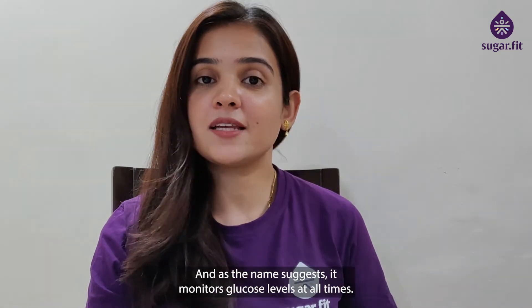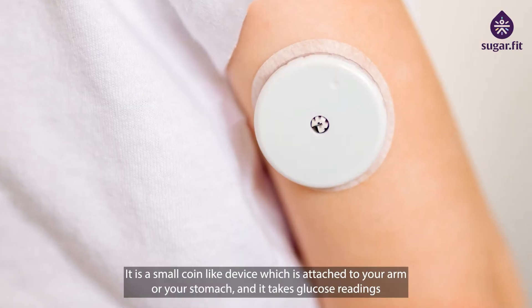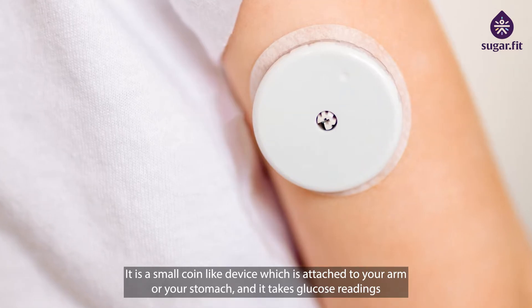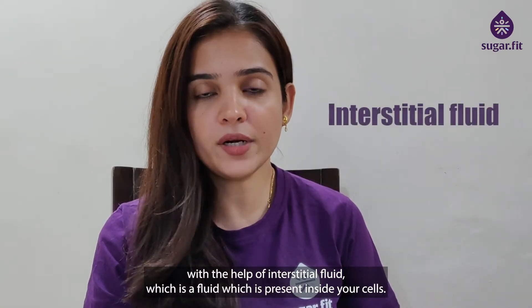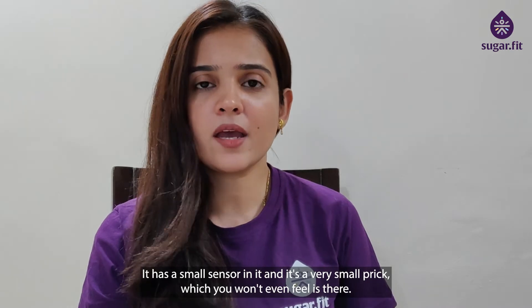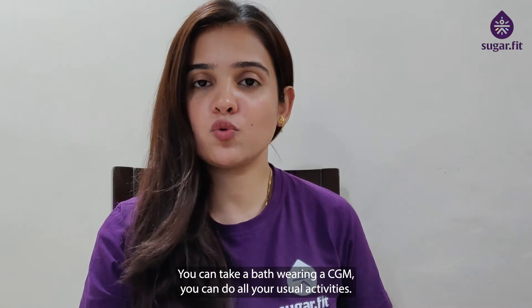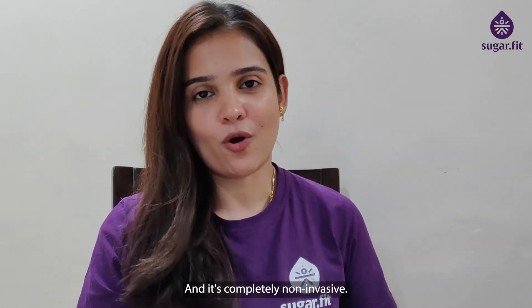CGM is a continuous glucose monitor, and as the name suggests, it monitors glucose levels at all times. It is a small coin-like device which is attached to your arm or your stomach, and it takes glucose readings with the help of interstitial fluid — a fluid present in between your cells. It has a small sensor and a very small prick which you won't even feel. You can take a bath wearing a CGM and do all your usual activities — it's completely non-invasive.